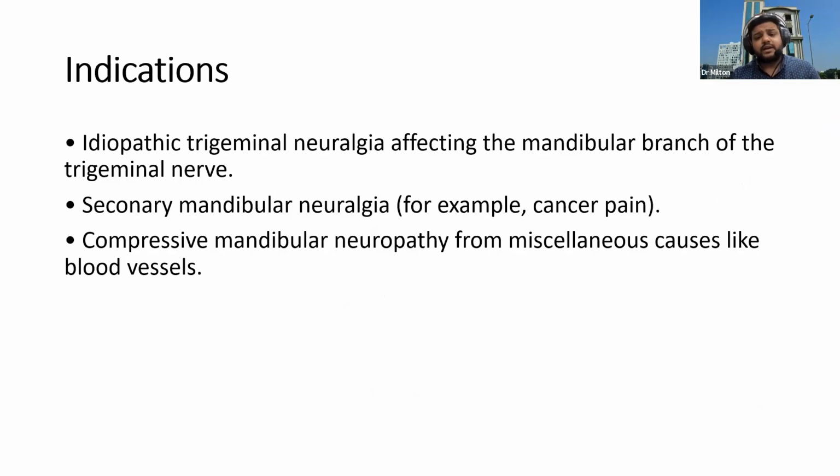Okay, so here are the indications: idiopathic trigeminal neuralgia affecting the mandibular branch of the trigeminal nerve. Secondary mandibular neuralgia, like from cancer, which causes continuous irritation of the mandibular nerve. And compression of the mandibular nerve from miscellaneous causes, like aberrant blood vessels, which cause outside pressure over the nerve and cause pain.